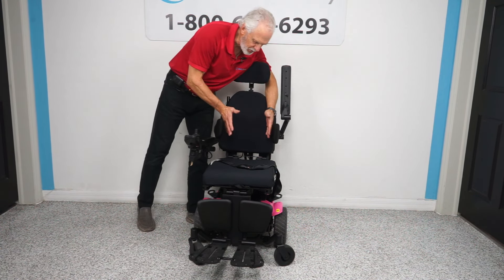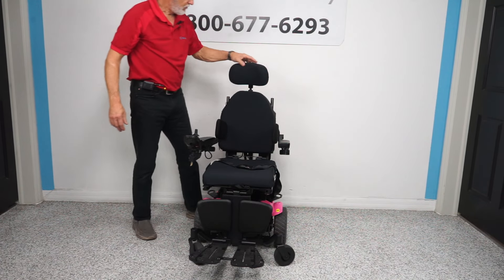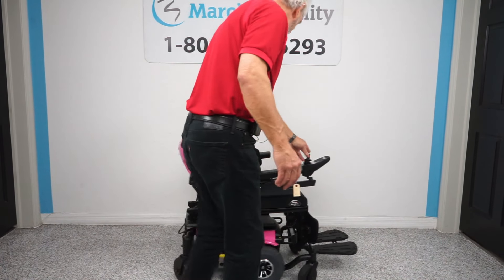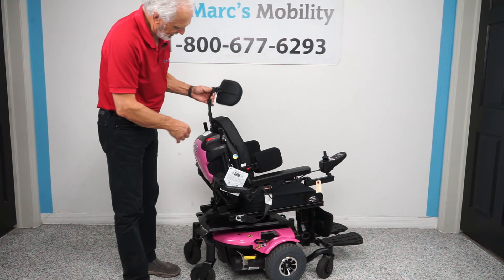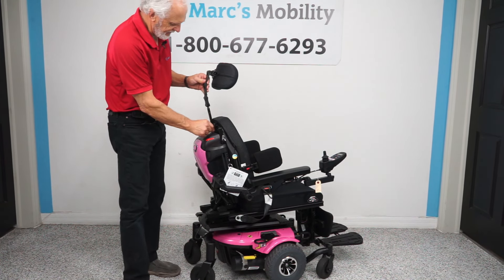The lateral chest guards can go in more or out more. As you can see, they're not tight right now, so they can be adjusted to whatever person you have. You also have a fully adjustable headrest back here — it's removable and you can adjust the height.